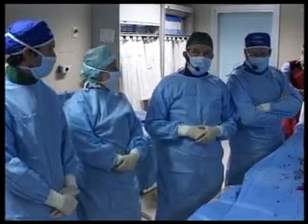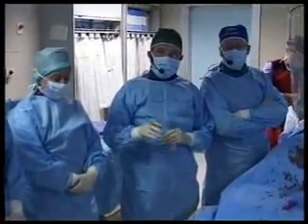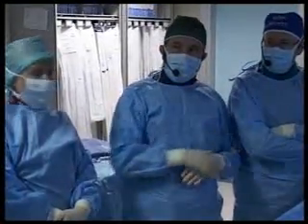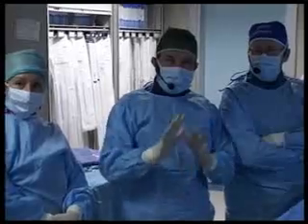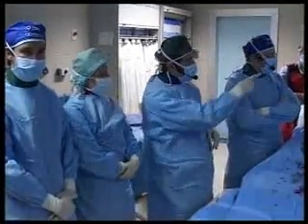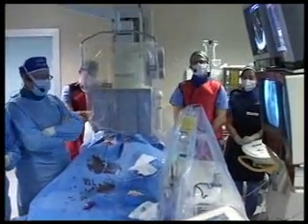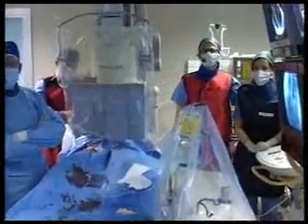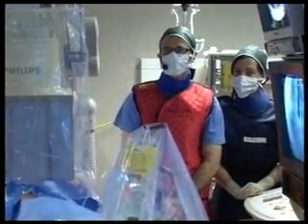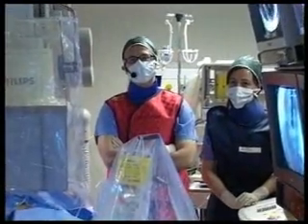Okay, so we are in the cath lab here doing the case of VSD. We have Lucien and Kevin and Gioca there, enlarge the field for a second. And Carmelo Arcidiacono will perform together with Rita and Mohammed the echo, the transesophageal echo. And now Carmelo will show you very briefly the summary of the case.